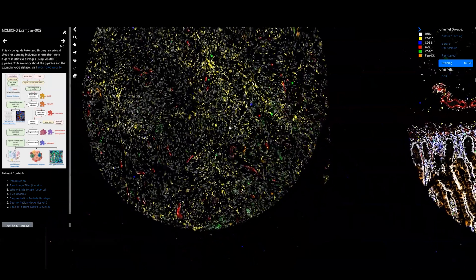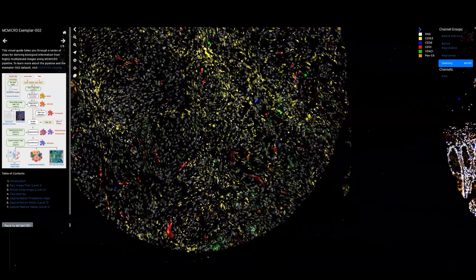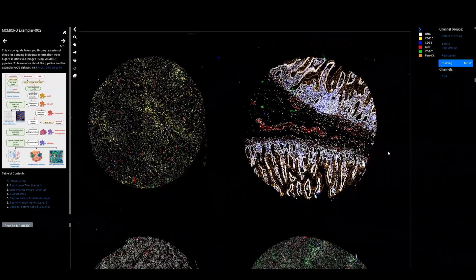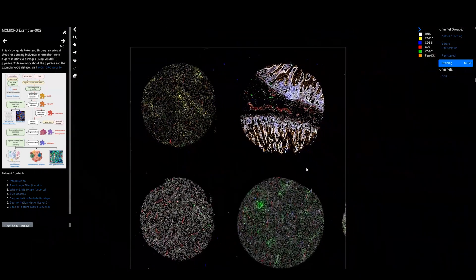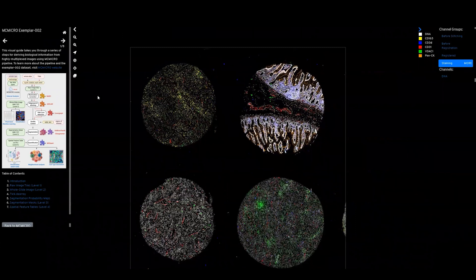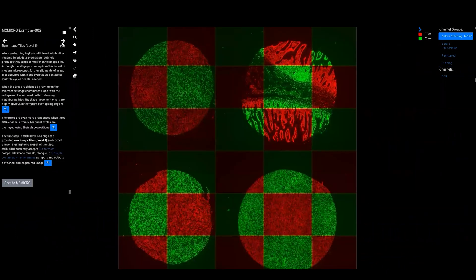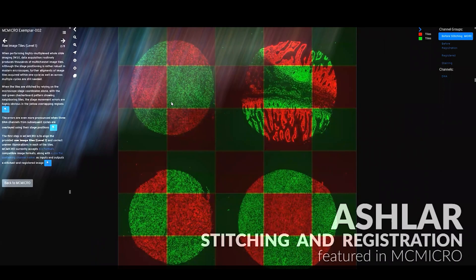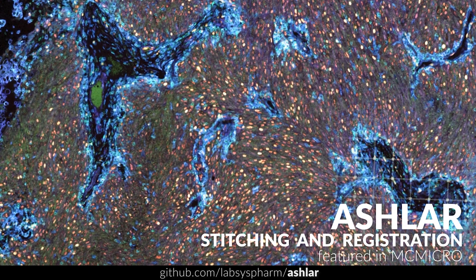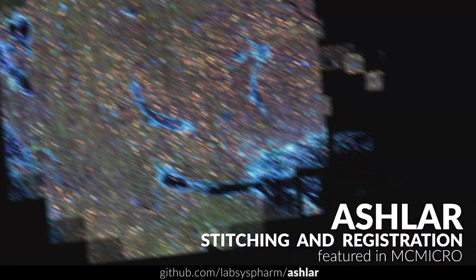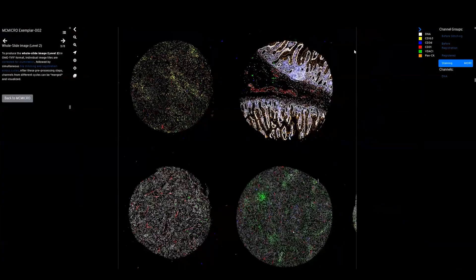Let's take a look at what it does using this interactive Minerva story. For those of you who are imaging whole tissues or large tissue microarrays, you'll need to sample your samples across hundreds or even thousands of fields of view and stitch these into one continuous montage. MCMicro applies stitching and registration algorithms, such as Ashlar, to do this across multiple channels. Here I'm showing just six channels, but we have recently registered 60 channels and beyond.